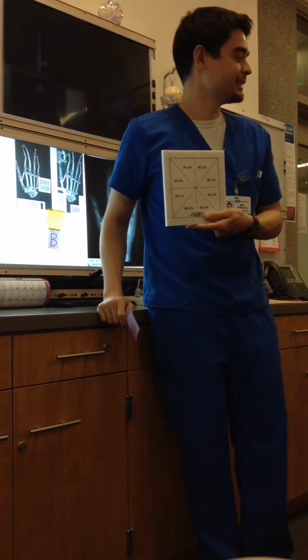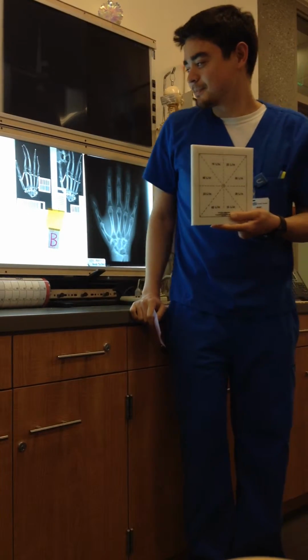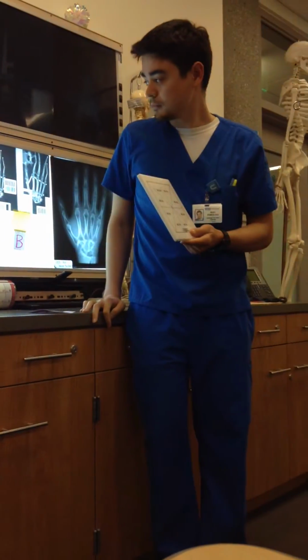It's like a bathroom tile. Okay, so what are you measuring? Resolution. Of lines per inch. Specifically, of the, look at your card. Oh, fluoro. Yes, that's what I was trying to get you to see. So show them that. That is a fluoroscopy resolution test tool, and that's what it looks like when you image it. You see the division here and the division there? See how it matches up?